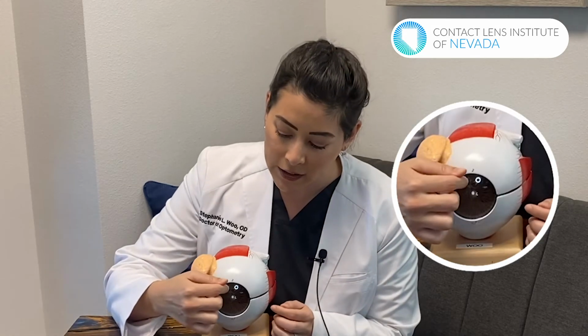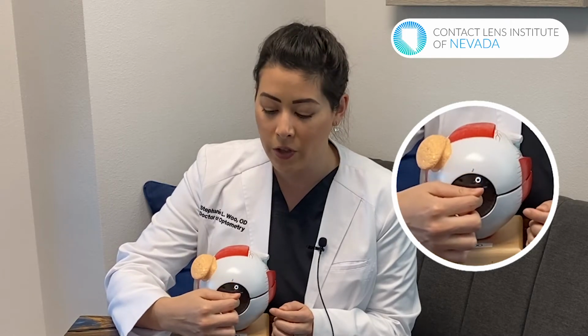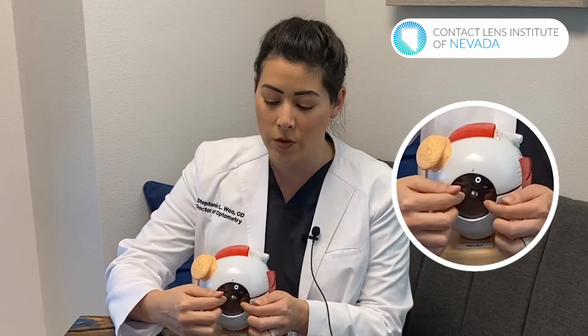After they do that, they'll use either a microkeratome or another type of laser that creates the flap. Most surgeons nowadays will use the laser, where they put some suction onto the eye and it creates tiny little dots on the front surface of the eye. Imagine hundreds, thousands of little dots that go in between the tissue of the eye, and that allows the surgeon to easily lift up the flap so that the next layer of the cornea is exposed.